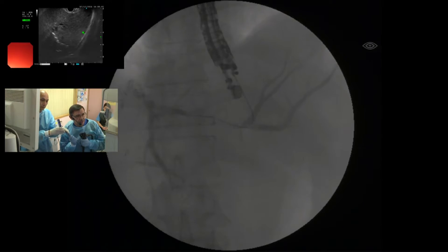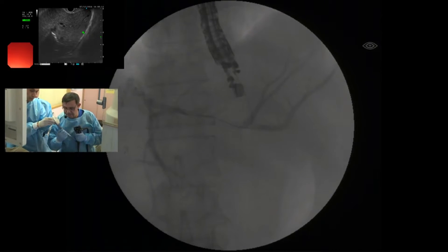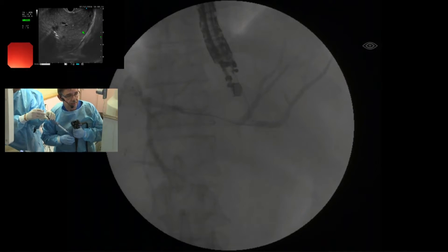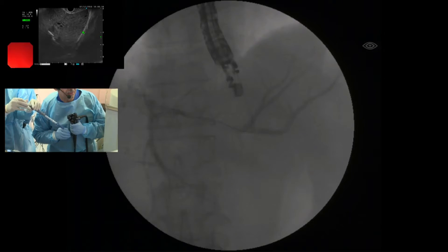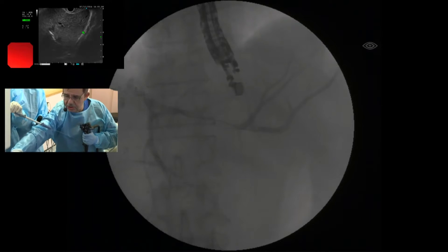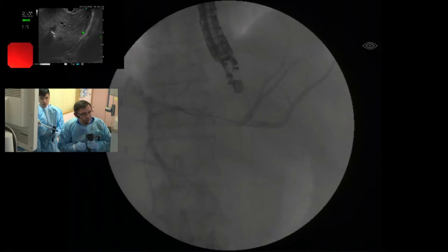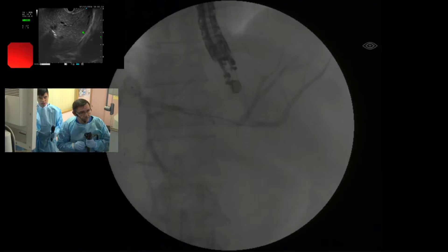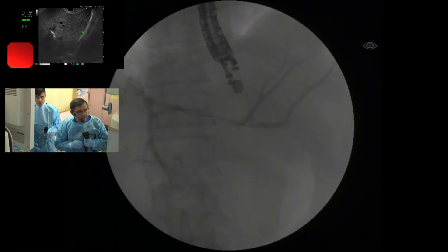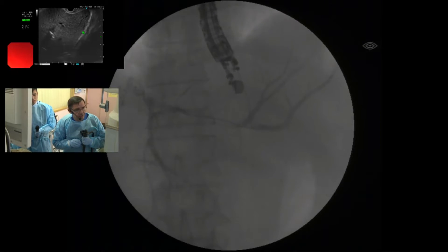Can someone hold the scope? I blocked the wire with my elevator — this is very important. Slowly — on the cystotome, you put this one. Okay, now we go.